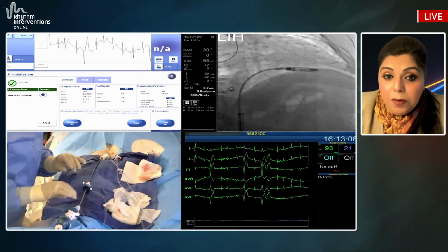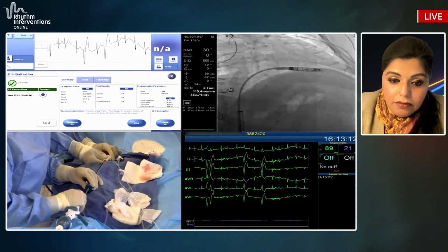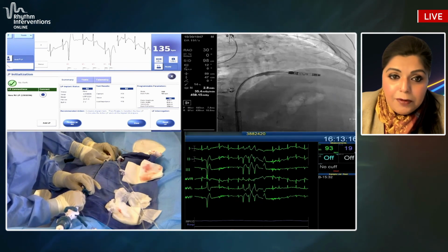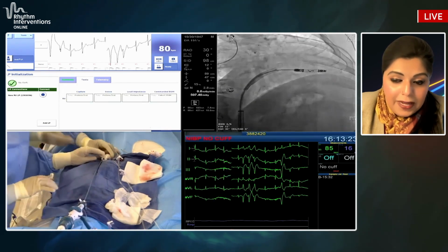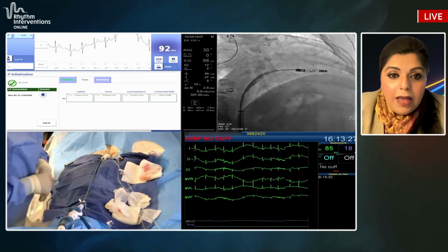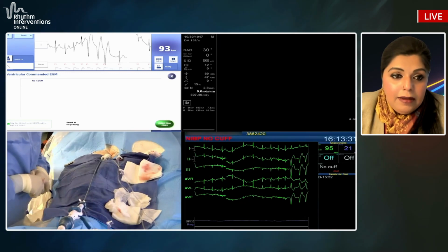So I have to expose the mapping electrodes. To do that, I'm going to unlock and retract my protective sleeve. So you can see me kind of pulling that protective sleeve back. Here is the protective sleeve kind of being pulled back. I'll pull it back and lock it in place. And then we can do what I call the pre-deployment mapping. So now you have the device exposed.